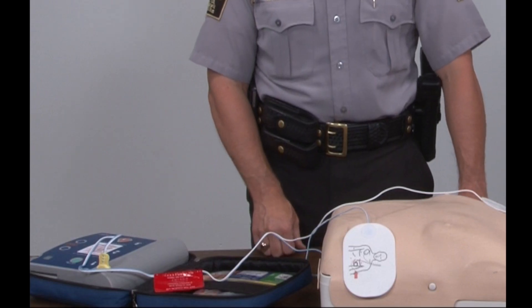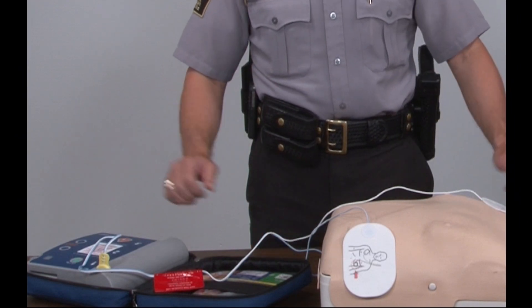The AED will analyze the heart rhythm — it will go through analyzation. Do not touch the patient; we should not be touching the patient at this point in time.